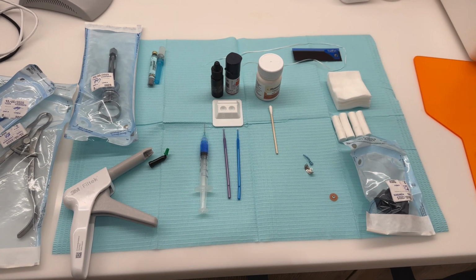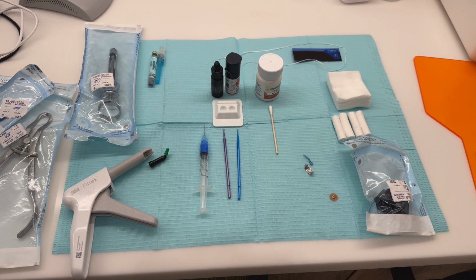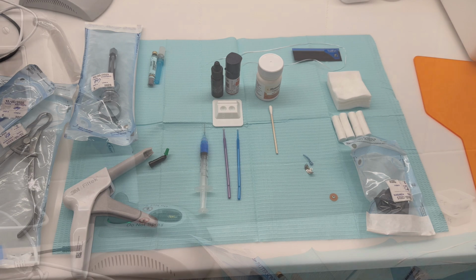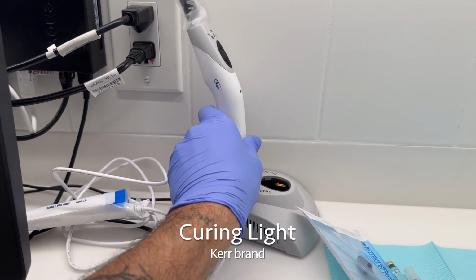A few other things you'll need on your setup: articulating paper as seen in the top right corner. We also have gauze and cotton rolls, as well as floss. These are some major components to a successful restoration. Next up, we have our curing light.